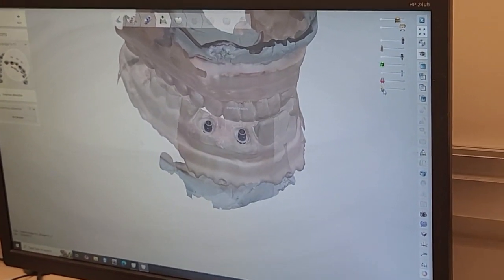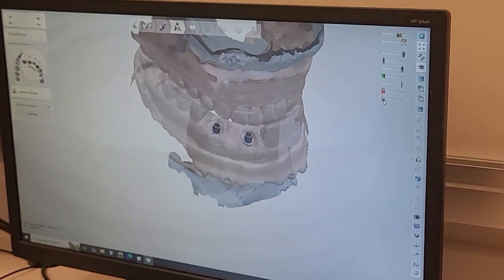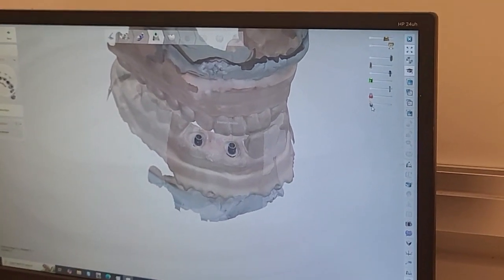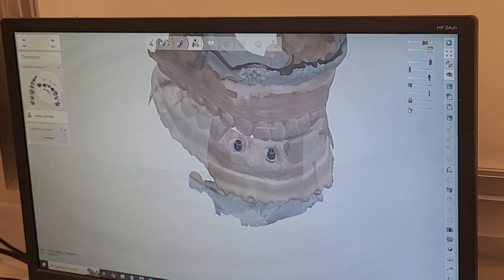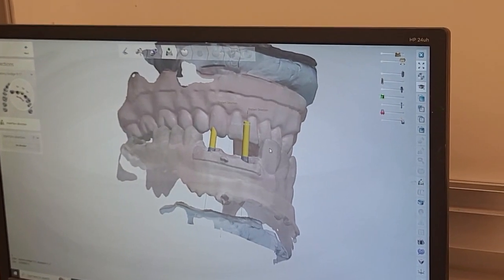And I'm gonna use, remember, I don't know if you guys are using that little long purple screw when you do the wax up on the anterior? Yeah, we didn't have those. We just used the burr. Oh, okay. So it's the same idea.